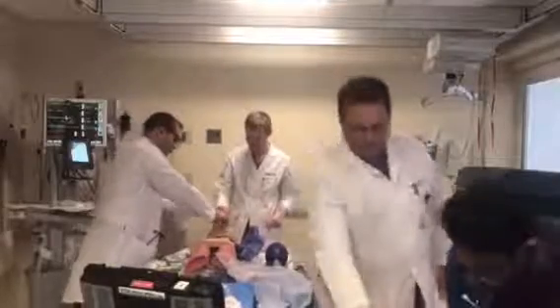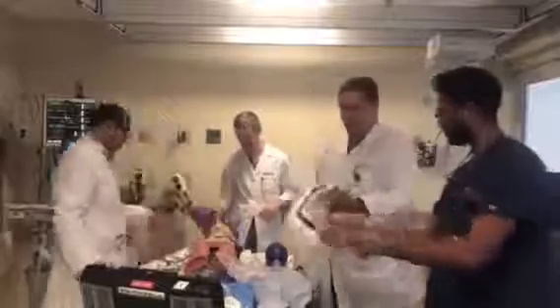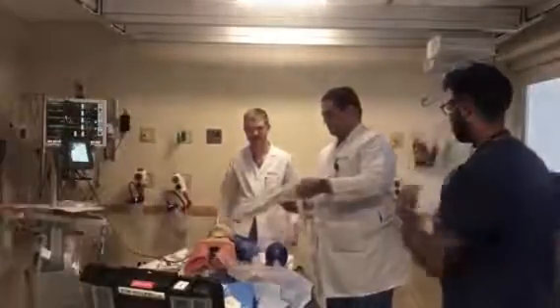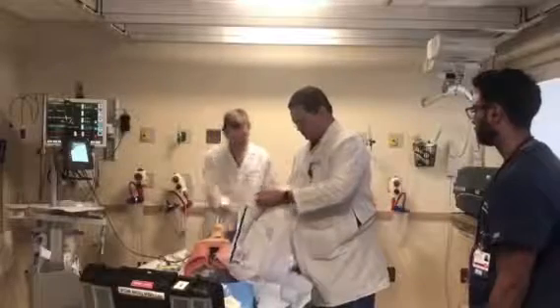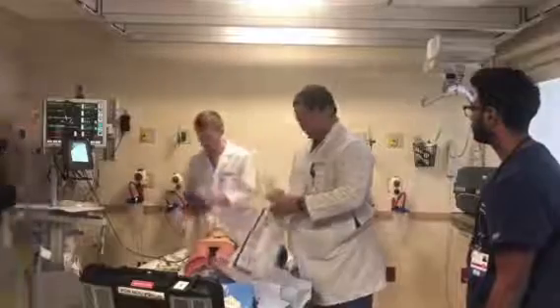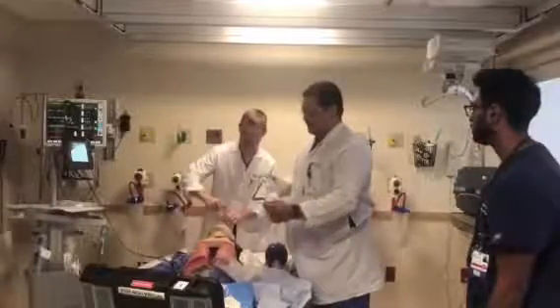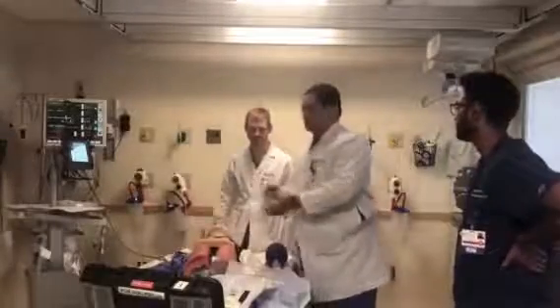So this is the combi tube right here. This one? Yeah. So this is the combi tube, right? So what we do, this is a combi tube. We're gonna open it. Right now the ER uses it and they call it the King tube, or the ambulances use it, they call it the King tube. It's the same thing, but they blocked one of the openings and it's shorter. But the combi tube is better.